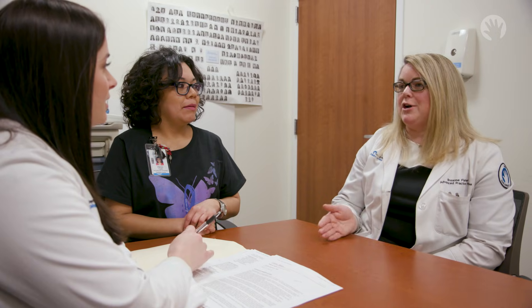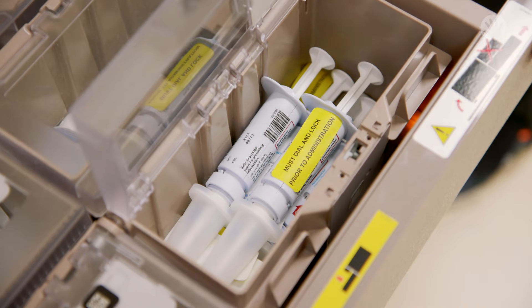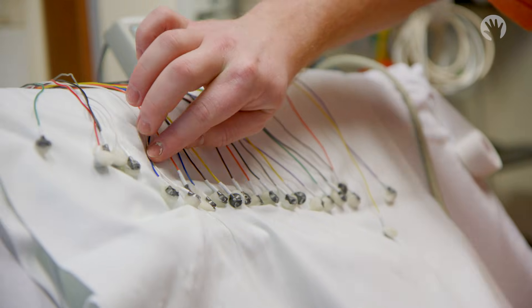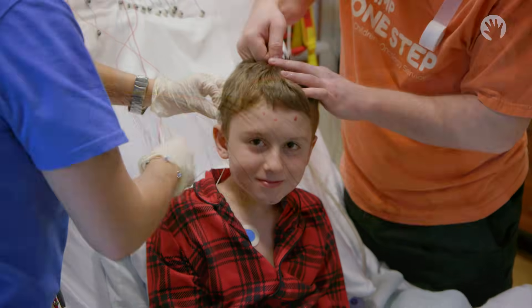Specific timelines as to at what point in time a rescue medication should be given, as well as what that specific rescue medication should be. Mainly we set up EEGs — electroencephalograms — which measure voltage change throughout the brain. We do that with a setup of 23 leads.